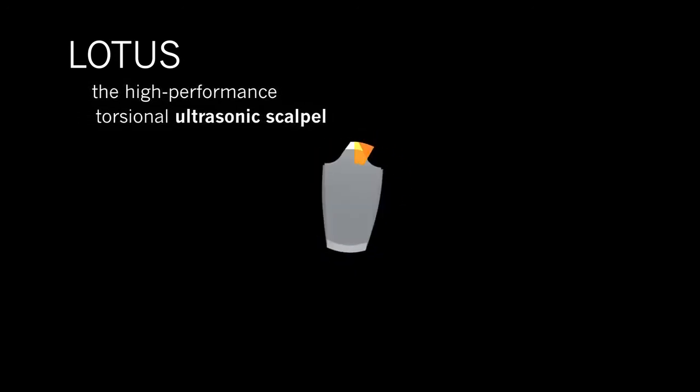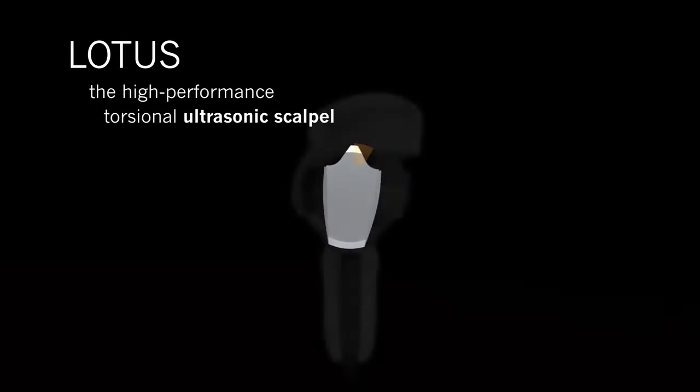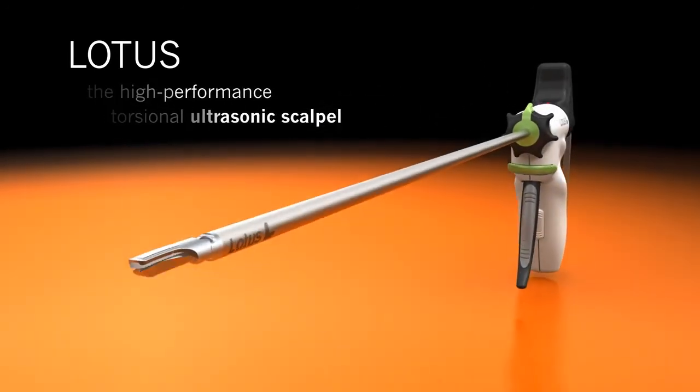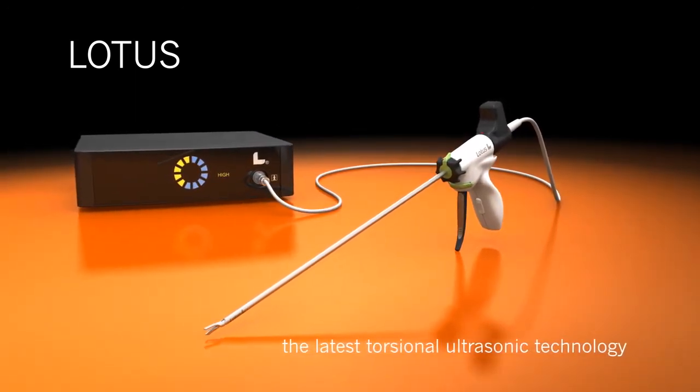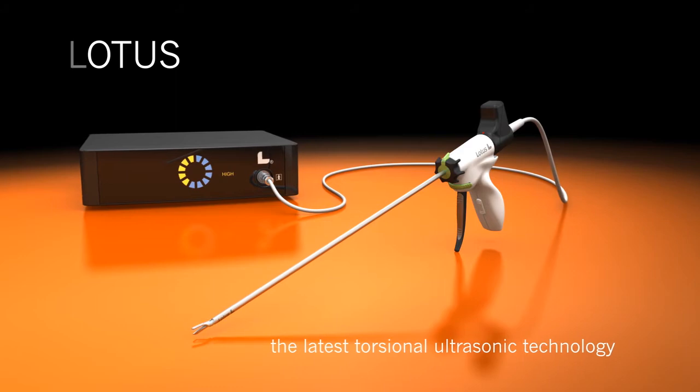Ultrasound allows rapid dissection and coagulation even without the use of high frequency current. With the Lotus system, you will enjoy the benefits of the latest generation of ultrasonic scalpels.